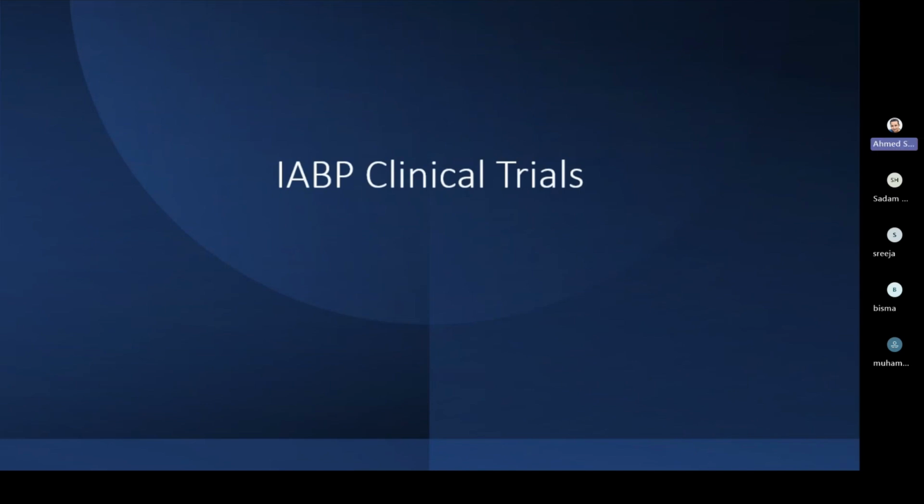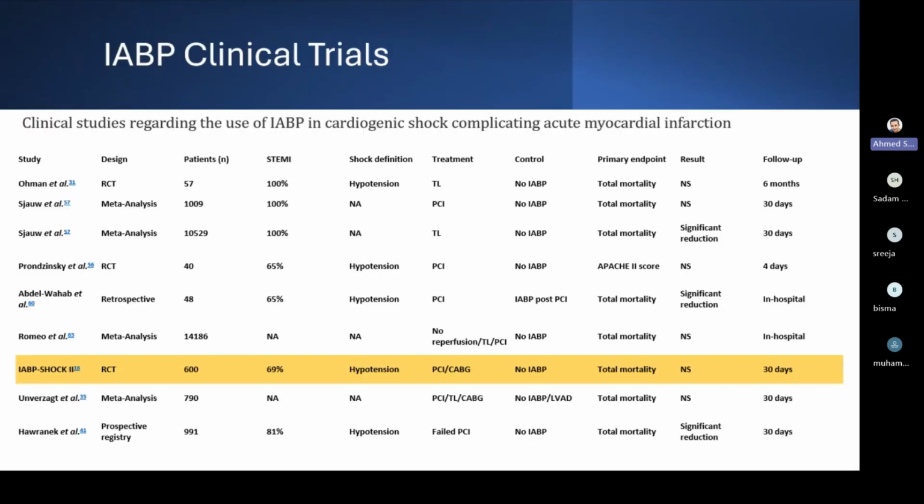Regarding the evidence behind the intra-aortic balloon, there are many clinical trials which assess its efficacy in decreasing mortality for patients with cardiogenic shock complicating acute myocardial infarction.